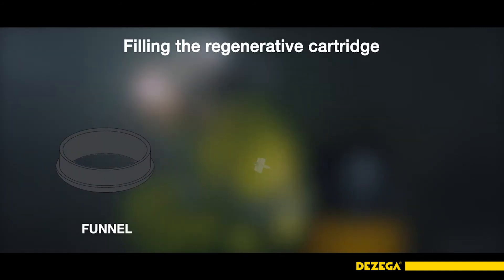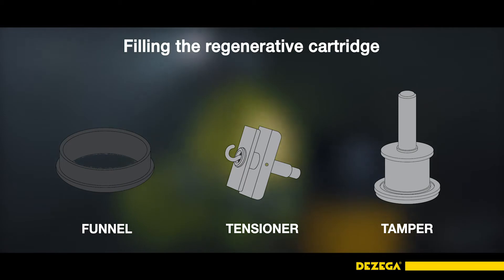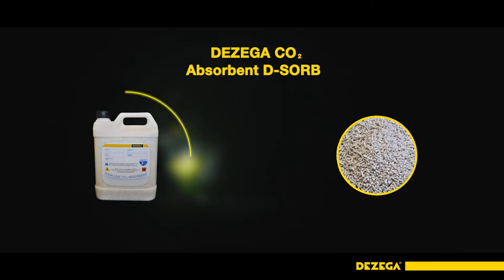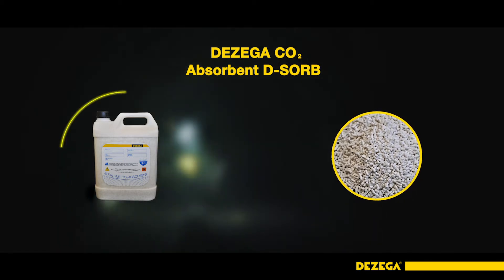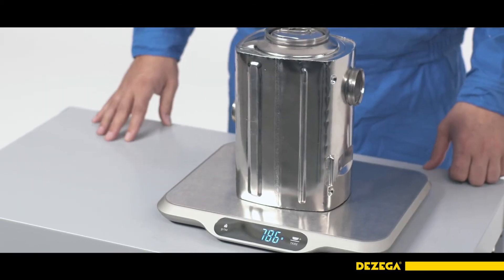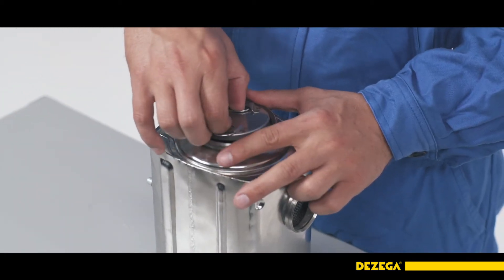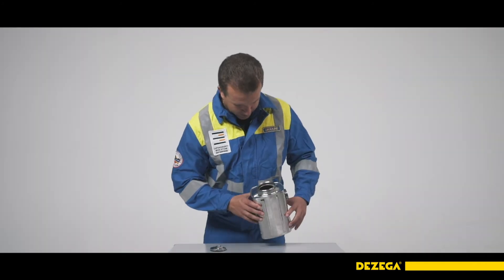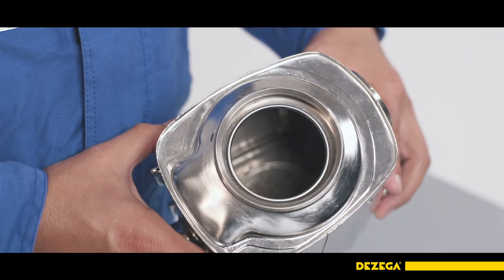The regenerative cartridge of the P30EX can be filled using a tamper or a funnel. Pour Disager CO2 absorbent D-Sorb through a sieve with 3mm holes. Use the remaining absorber to fill the cartridge. Weigh the empty cartridge with a plug with an accuracy of 5g. Press the clips together and remove the regenerative cartridge plug. Make sure no waste absorbent remains in the cartridge and that it is cleaned, disinfected and dried.